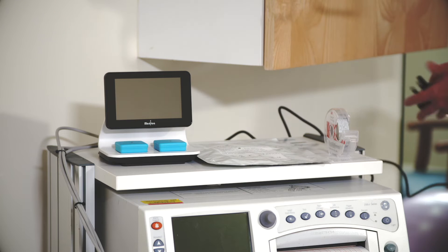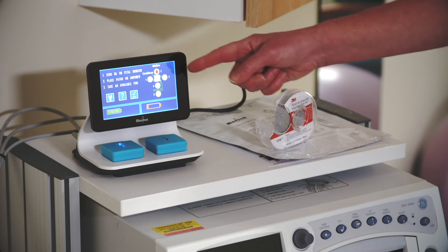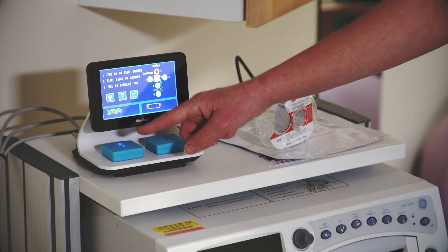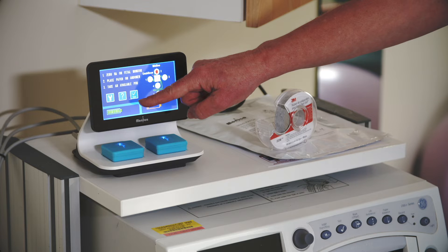Now connect Novi to the AC power outlet. The Novi does not have an on-off switch, so after a few seconds you will see the Novi's start screen. Above each of the pods in the charging bays is a battery icon showing the battery status of the pod below. A green battery icon is good – a minimum of 4 hours with up to 11 hours if all green segments are showing.